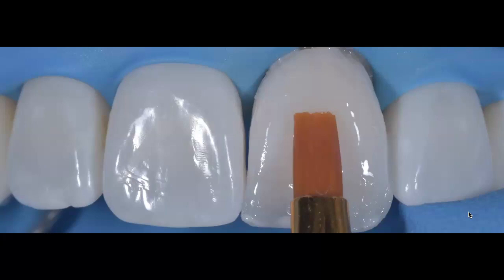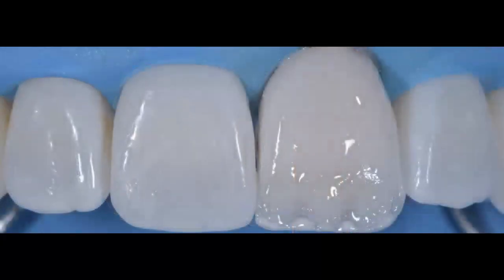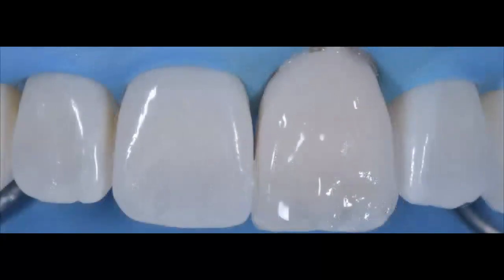So now you can see that I'm building that middle third, again using the OBL dentin from the Brilliant Everglow system. We're coming down. You can see that we're already achieving that very high value enamel. And then at the end, we're going to place our final layer of that bleach translucent from the same system, Brilliant Everglow.